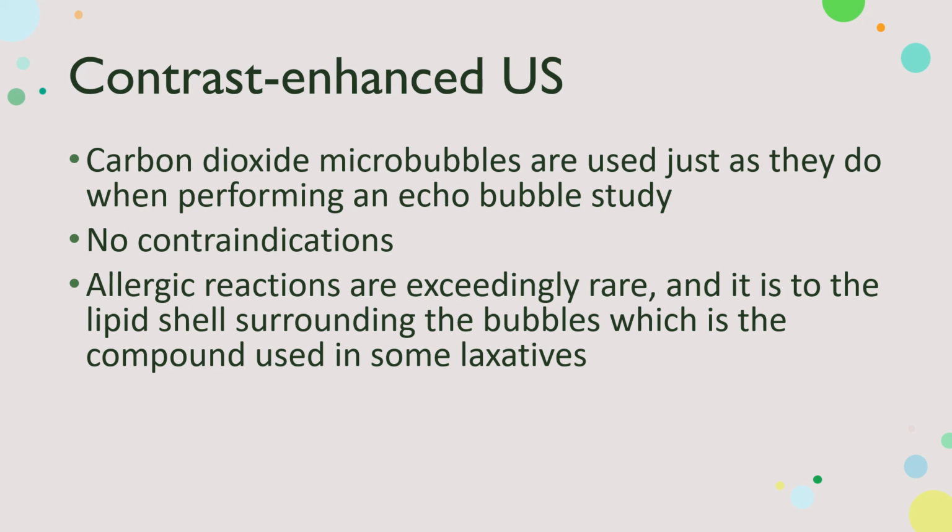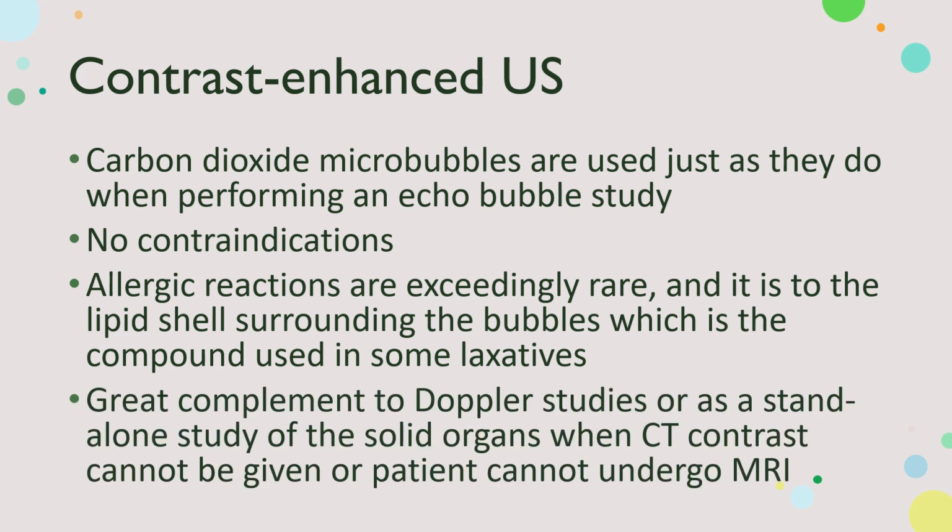So what we do is we ask them if they have had an allergic reaction to a laxative before. So those polyethylene glycols that make up the lipid shell that the carbon dioxide bubbles are encased in is also found in some laxatives. So we always ask the patient if they've ever had a reaction to a laxative. They always say no. So far we haven't had any problems.